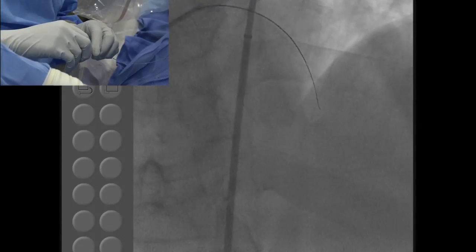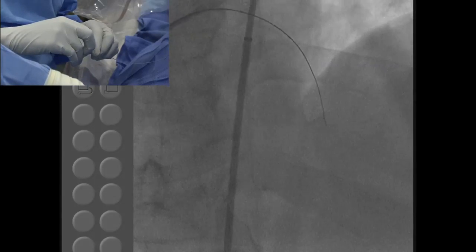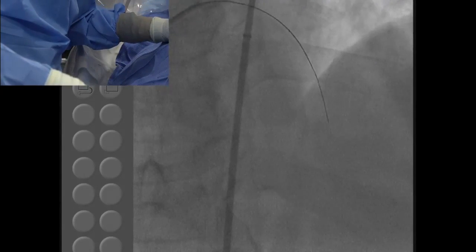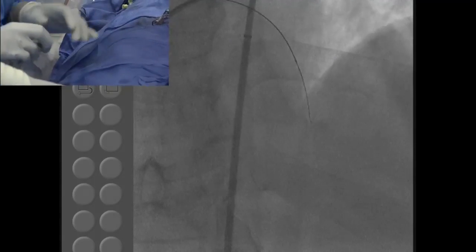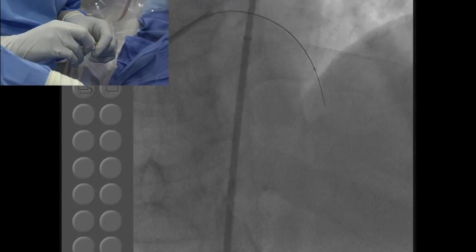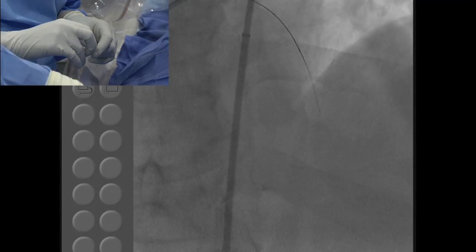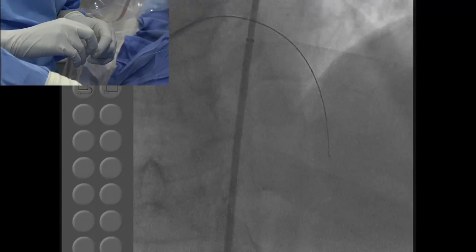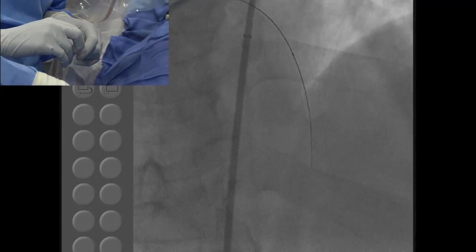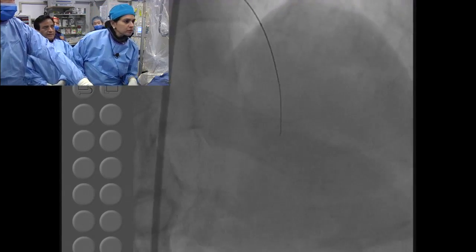But overall, if you can succeed antegrade, because every study of the retrograde has shown longer procedural time, higher fluoroscopy time, higher contrast use, relatively higher complication compared to antegrade, and longer stent length. So if your choice is, you want to try antegrade twice, that's what has been our teaching. Fail, then you go to retrograde. And they did try the Stingray device in this study also, but that did not have much impact. Again, a very small number of cases, I think 10 cases were done with the Stingray.